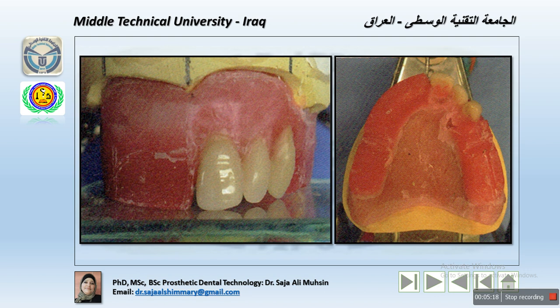The distal aspect should be pointed down the wax blocks to link into the posterior teeth and create a natural looking buccal corridor. The neck of the canine should be prominent and more anteriorly placed than the incisal edge to emphasize the canine eminence and to support the lips, as in the image on the right side. So the position of the canine will be slightly prominent.